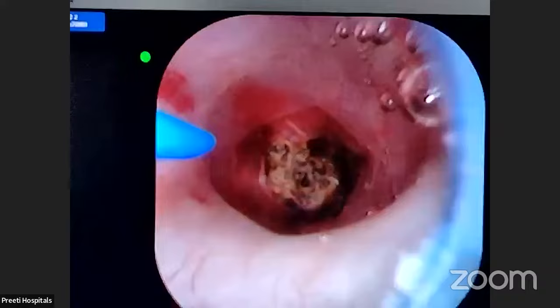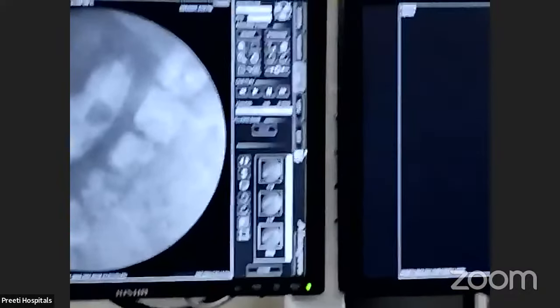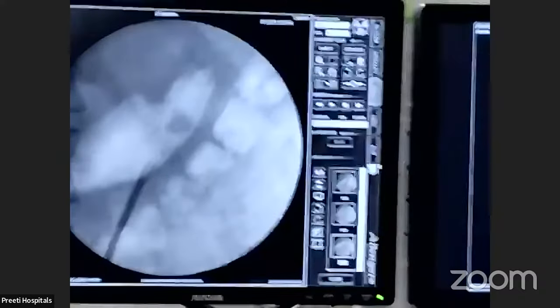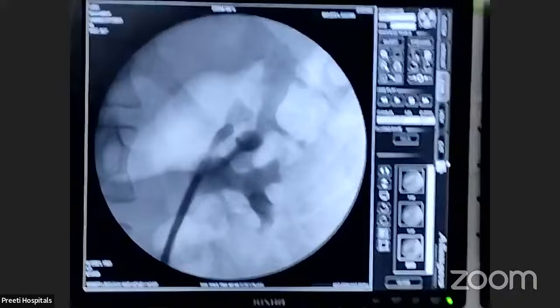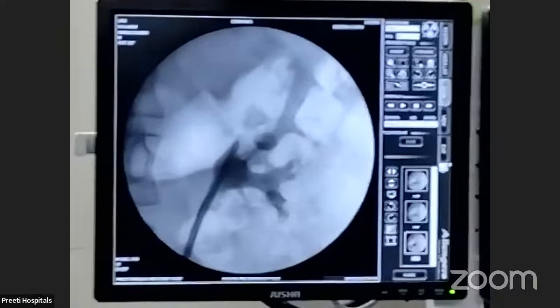This is the picture. Can you see it? If you can inject contrast, see also. Give me some contrast so that I will inject it. What type of anatomy? Suck it first, empty it, and then inject contrast. Don't suck now. Can you see the contrast? And now I will stop it. In a normal case, this contrast cannot be sucked. But in this case, contrast can be sucked out. Now suck it out. Yes. So there is no problem.